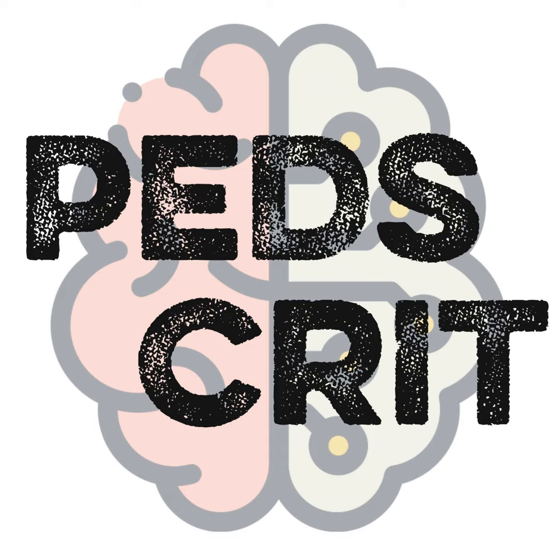But despite that, most adult trials have tried to keep tidal volumes less than 6.5 per kilo. Most pediatric and PALISI recommendations are to keep it less than 8 per kilo for most areas, less than 6 per kilo when you become really stiff. Despite all this, plateau pressure and PIP, because as we discussed, if your inspiratory flows are going to 0 it's not that much worse, is the most commonly discussed metric that people use to monitor this, and that is what I use to monitor this also.